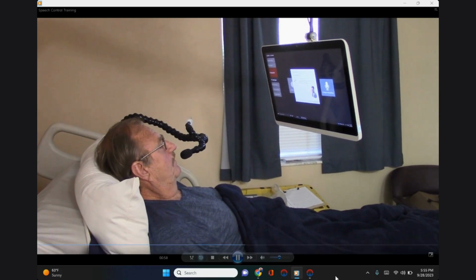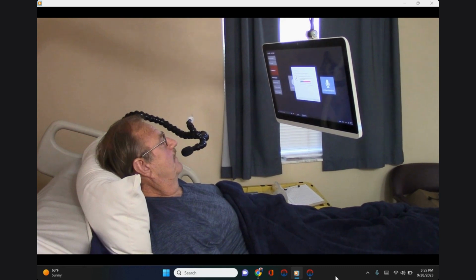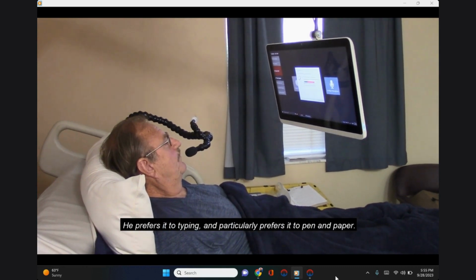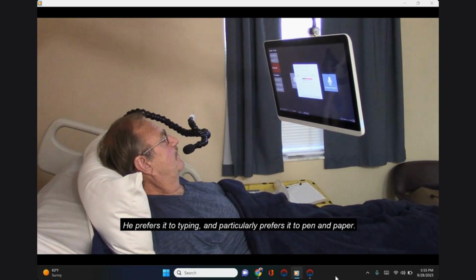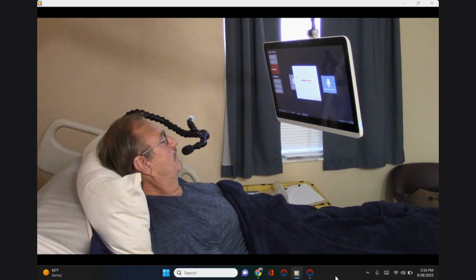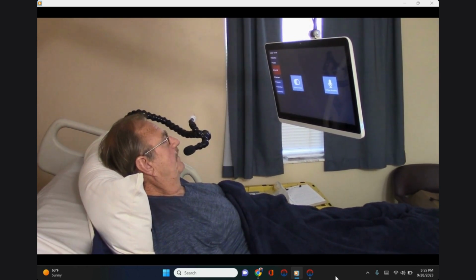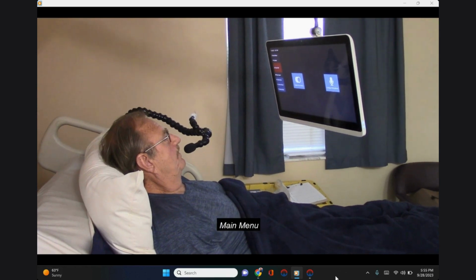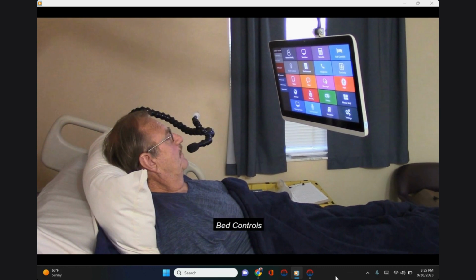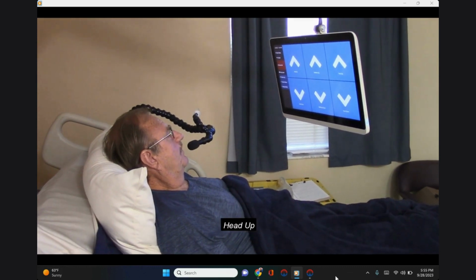Next. Next. Peter dictates to his computer. He prefers it to typing and particularly prefers it to pen and paper. Next. Finish. Main menu. Bed controls. Head up.